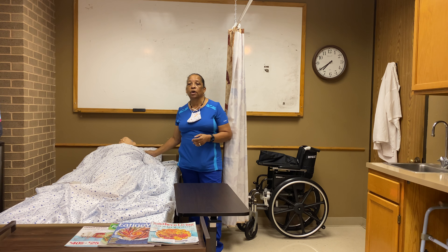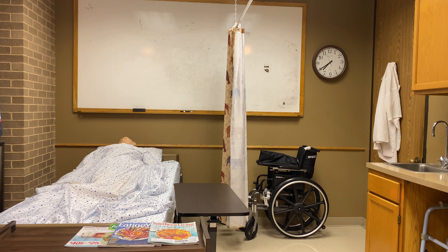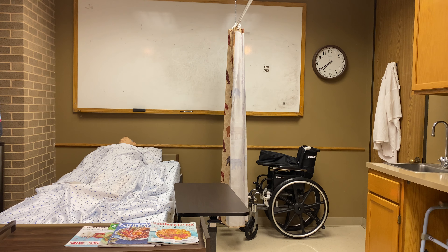We will be demonstrating catheter care. When you do catheter care for your nurse aide state exam, you will be doing it on a mannequin. I'm going to start the demonstration now, so I'm going to exit and come in through the patient's door. Hello, Miss Mary. My name is Dr. Lee. How are you doing today? I'm here to provide catheter care for you, so I'm going to close the curtain, wash my hands, get my supplies, and I'll be right back.